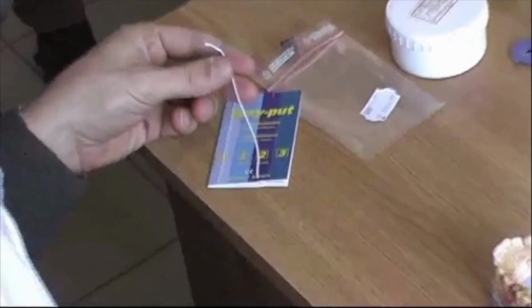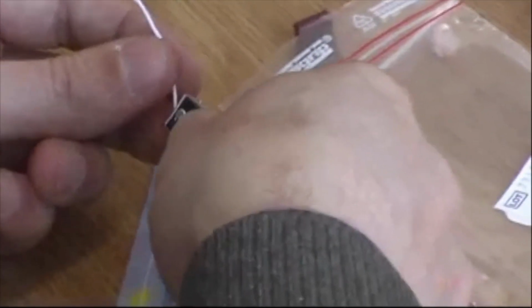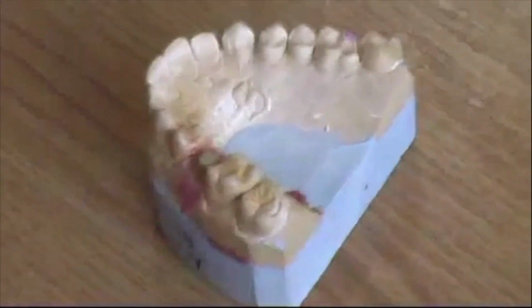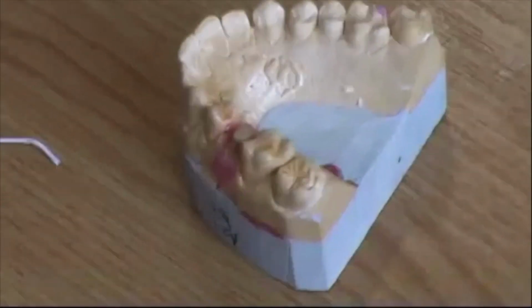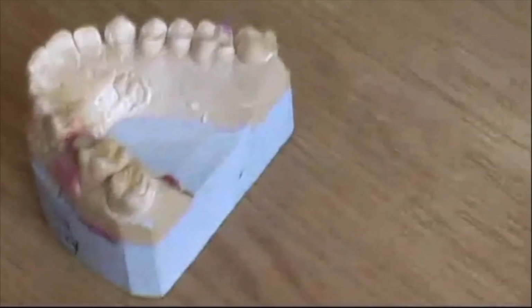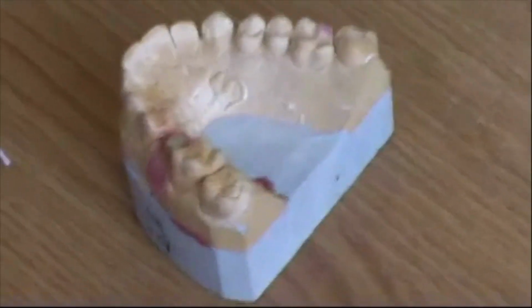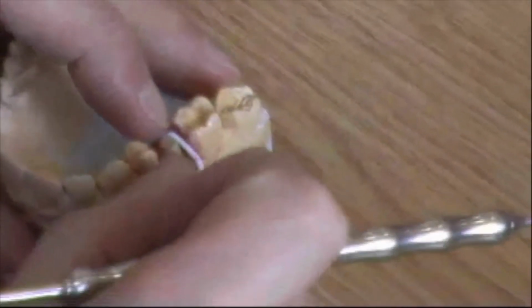And some techniques require double cord. I don't use those techniques. I don't like them anyhow. But some techniques require this. We want to avoid the putty from getting on the preparation itself. So don't imagine that this second cord will get into the sulcus, because then the sulcus is what? To park a tank there. There's no such sulcus. Now this is to be placed over the margin of the preparation, just to prevent the putty from getting to the margin of the preparation.